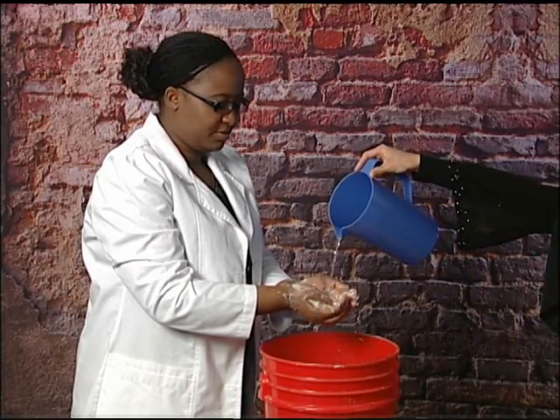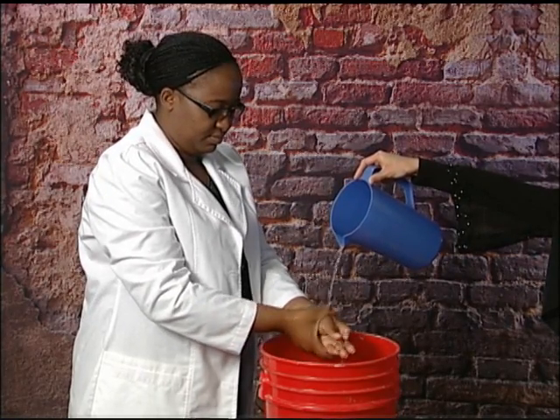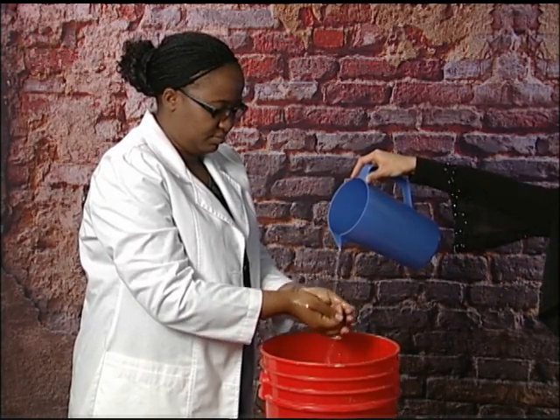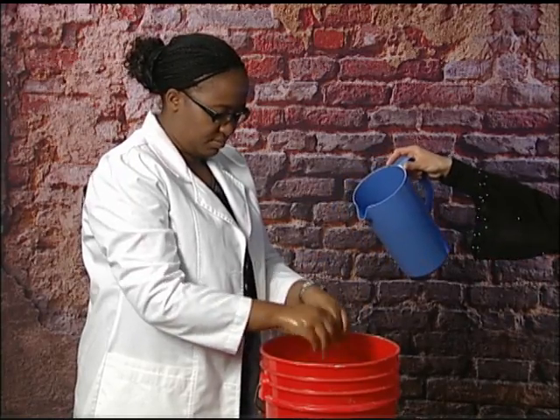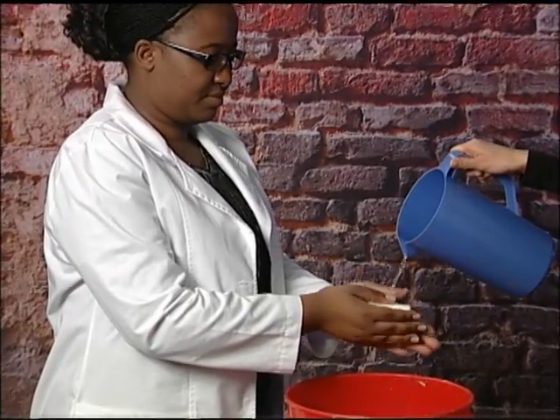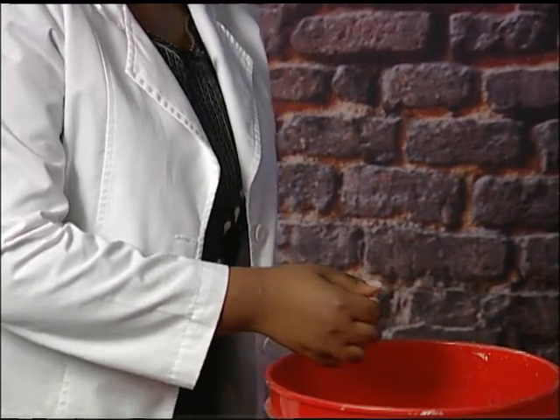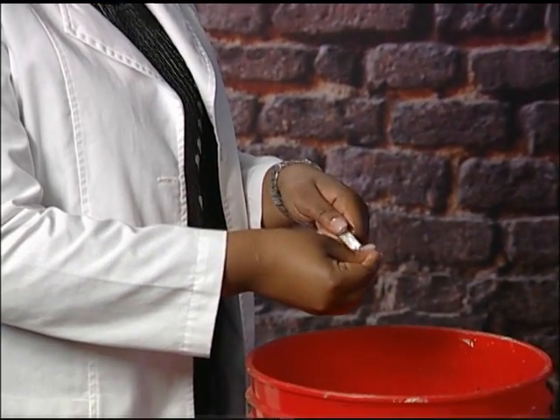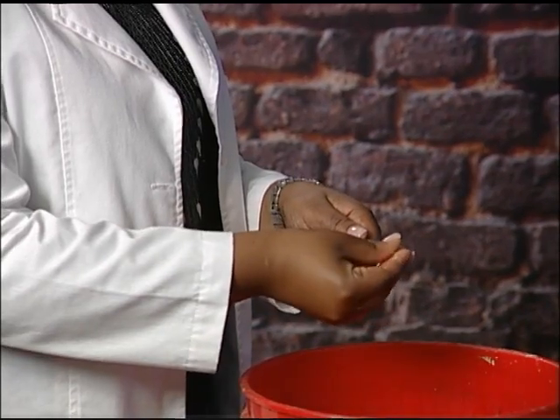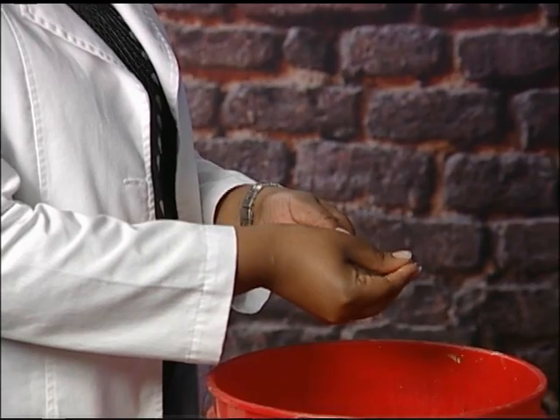Then rinse with clean water. To clean the glass thermometer with soap, first rub soap in your hands. Then rub the end of the thermometer with your soapy hands. And then rinse with clean water.